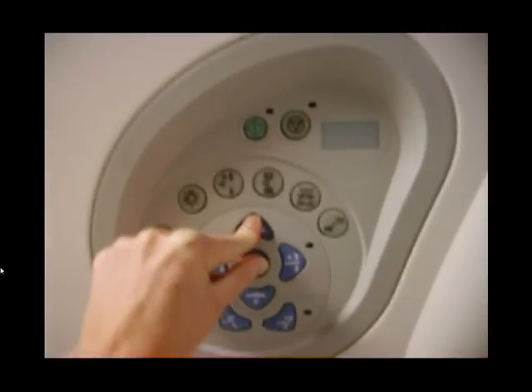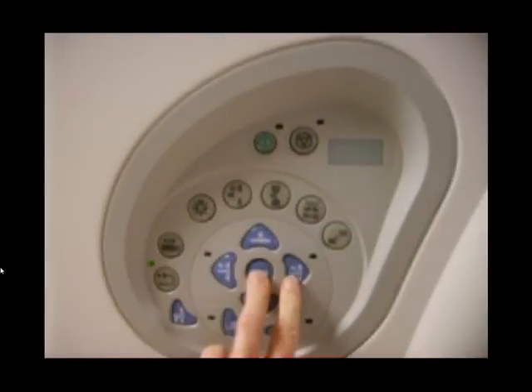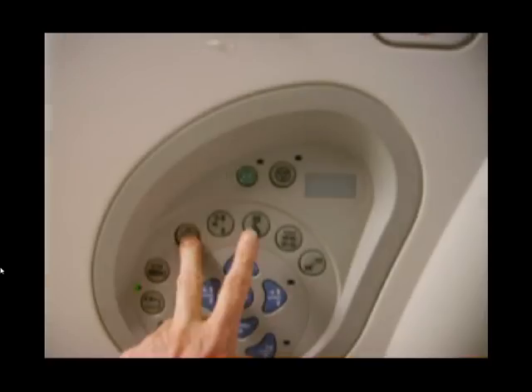Now you're going to move your patient in. You'll use these two buttons. And you can check and see that they're moving in. Then we're going to go back and turn our positioning light on. Remember, this is the axial positioning light that you use.